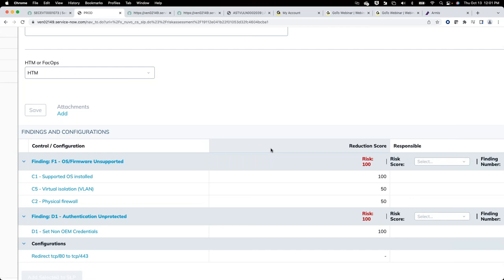Oh, okay. Yeah, exactly. So this risk score is based on, you know, we're about to buy these devices, whatever. This is operating system, CVEs, whatever we're analyzing here. Can we compare that to devices that we already have that would be replacing?